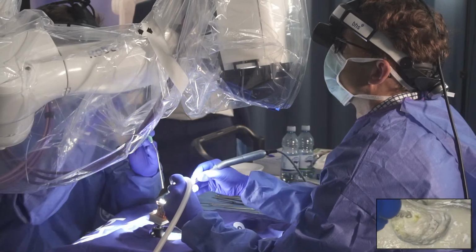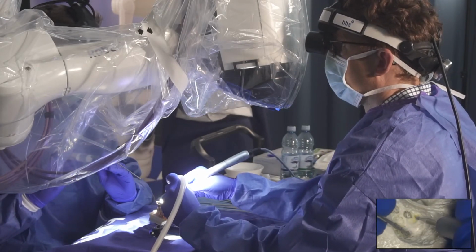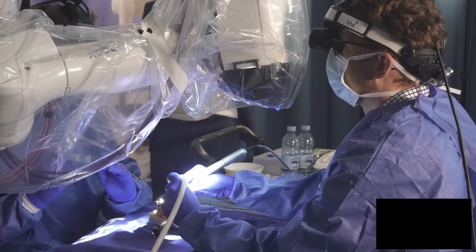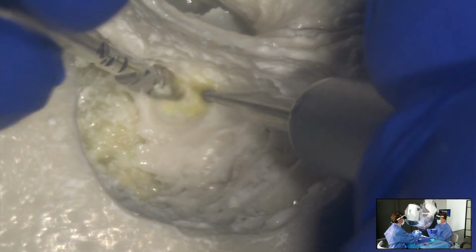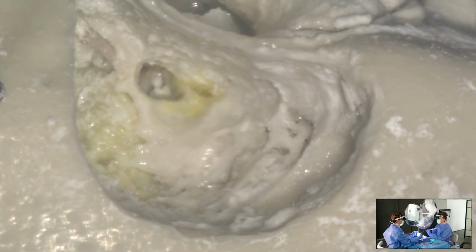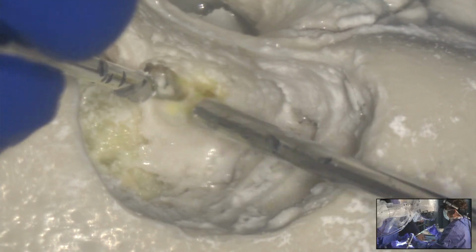A little bit more. Okay, so we have a little bit of dust in here, and we now have to try to get that out. This is a little bit sticky on this model. The burr dust is something else than the bone meal we normally have, and we have to now rinse the middle ear, and I do it by myself because I think we don't get the material out otherwise.